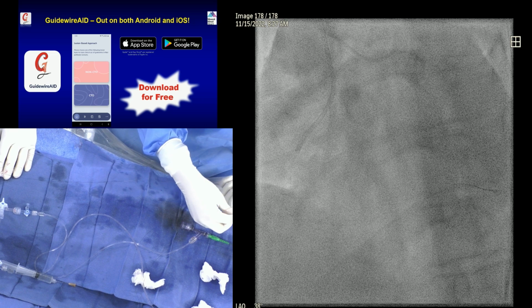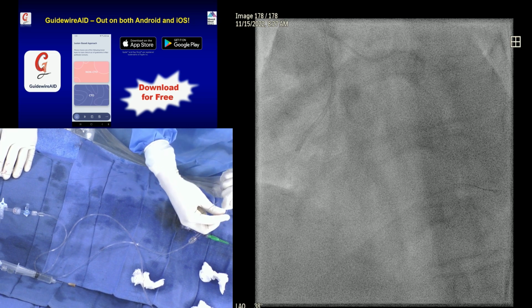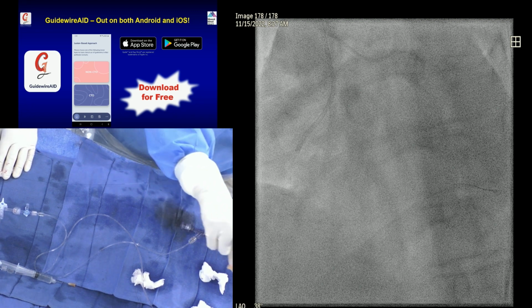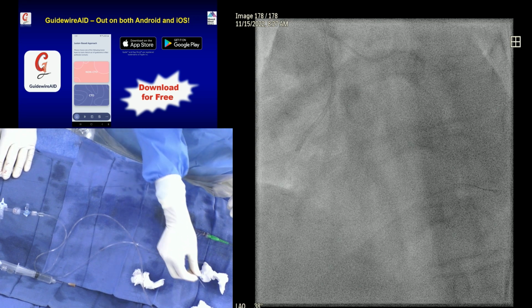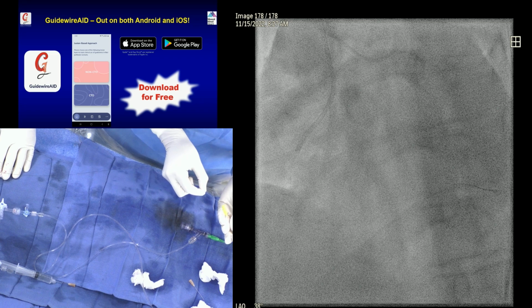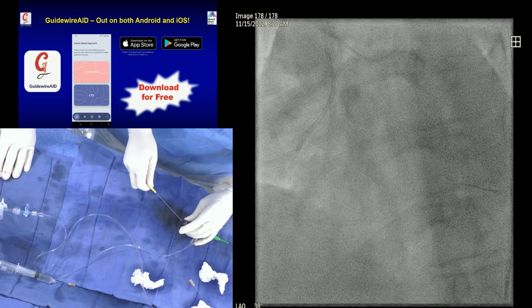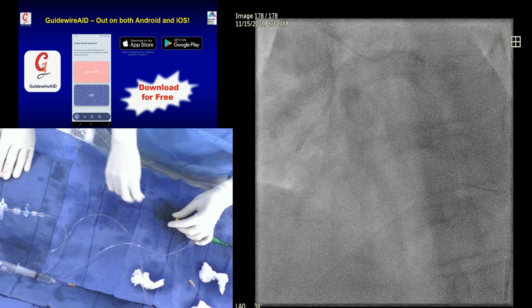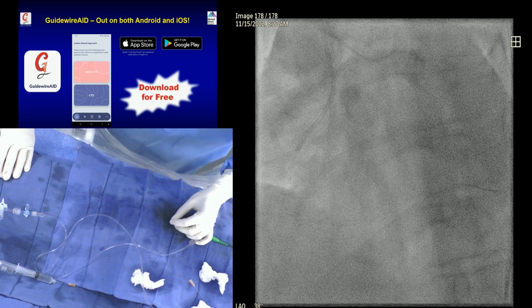Ostium. So the question is, if you put a stent just before, remember there may be an issue in terms of landing exactly at the bifurcation. No, you can use the retrograde angio and then place it at the bifurcation. No, that is true. But the question is, if there is a little bit of ostial pinch, it will be more troublesome. If we can get through a little bit here, we try. Otherwise, no. You can wire afterwards.